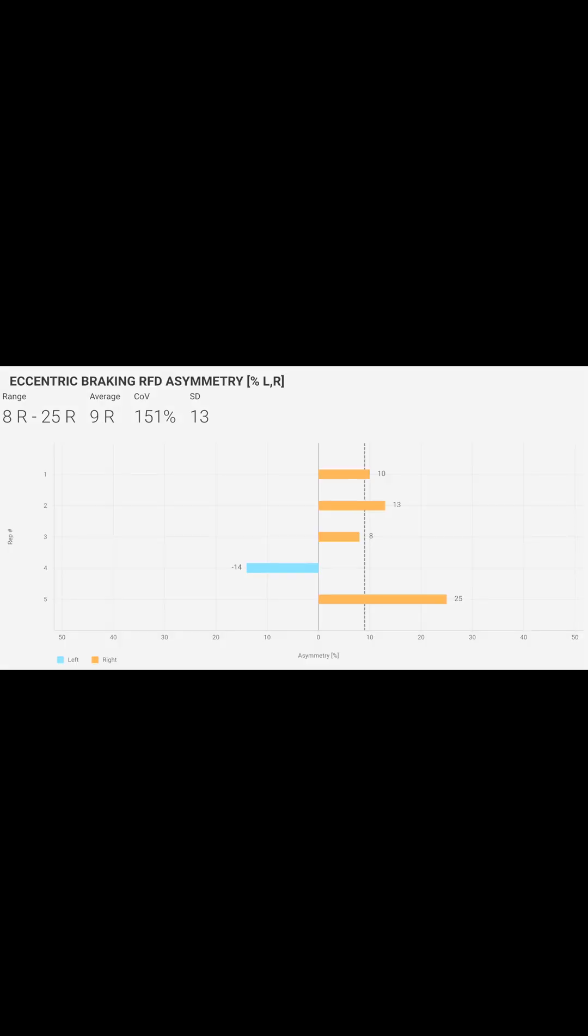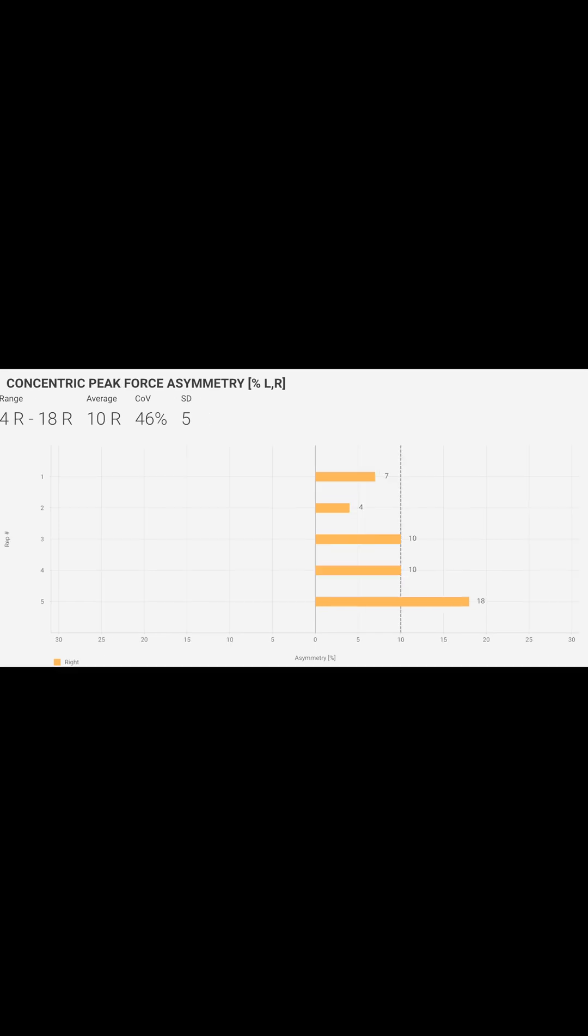There are two other ones that we like to look at with asymmetries. Eccentric RFD is how we're throwing on the brakes with a landing. We want to make sure there's less than a 10% asymmetry with our athletes. And here we're looking at concentric peak force asymmetry, which is how much are we pushing off with each leg.